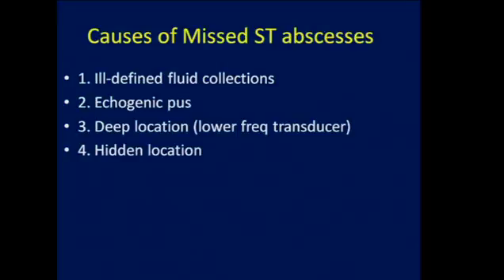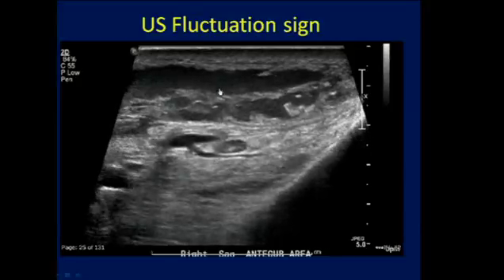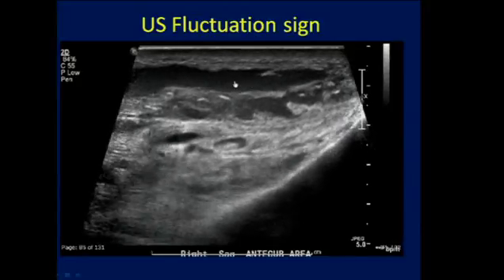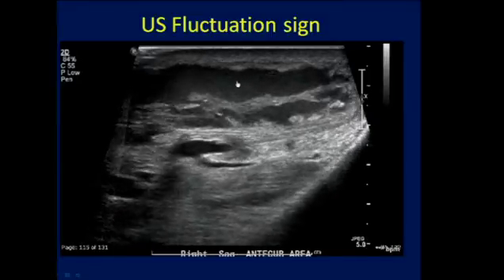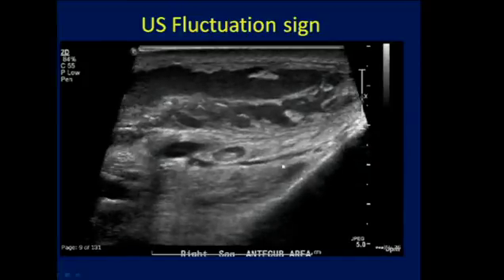Also look in hidden locations. Ask the patient where they hurt the most, specifically beneath the scrotum. That's an area that's frequently missed in my experience. We talked about the ultrasound fluctuation sign, and let me show you. Here's an area, the same fluid collection. We're compressing it. You can see the material moving as we compress the fluid. So this is not just inflammatory material. This is actually infected fluid.